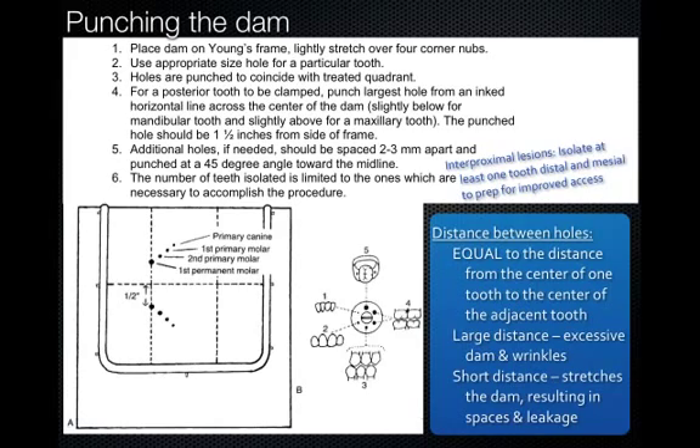I'm going to highlight a few very important points. You want to make sure that you use the correct size hole of the punch for each tooth that you're putting the rubber dam onto. A lot of students tend to use the largest punch hole for every tooth because they remember having trouble placing a dam in the preclinical lab. This isn't a good idea because when the holes are too large, the dam does not hold itself in place — it tends to pop off of the teeth. If you use the correct size hole, once the dam goes over the tooth it will snap down below the CEJ and hold itself in place.